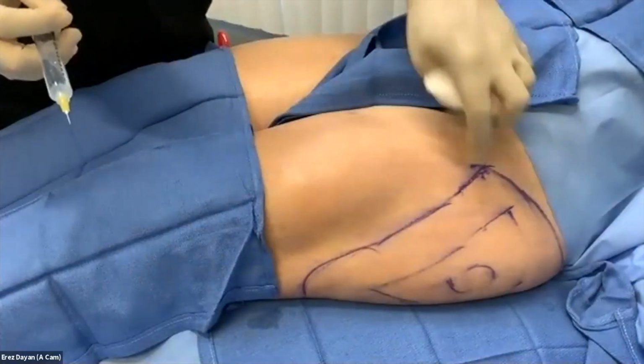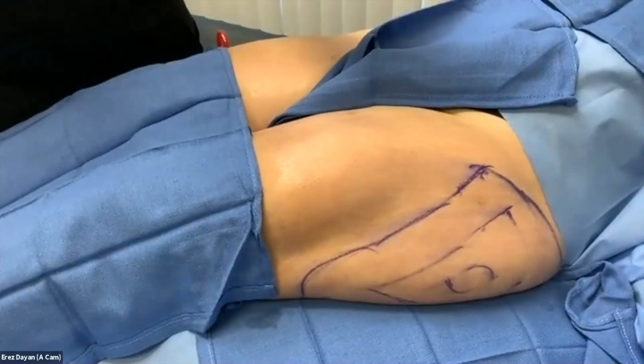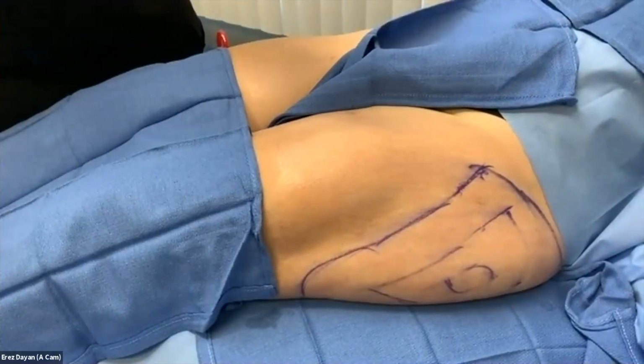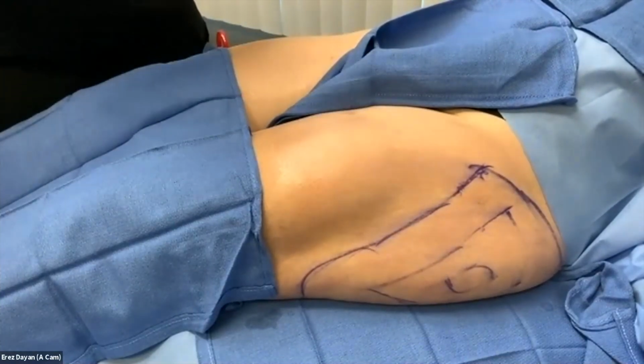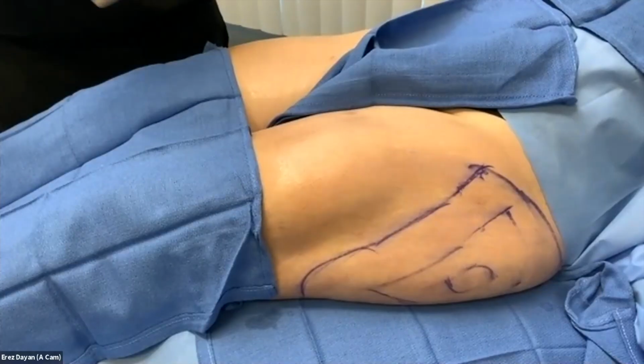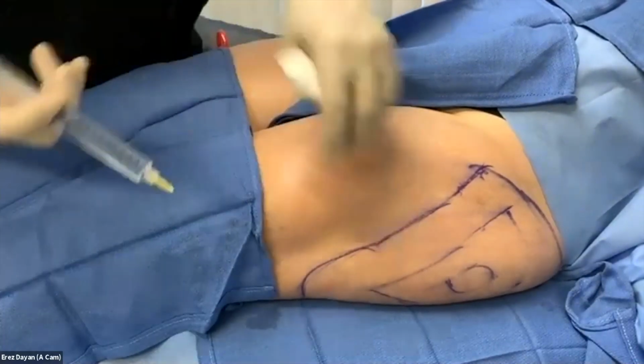So basically, when she was standing up, I simply marked the areas just like I would for a lipo case, because I am going to do lipo at the end of this. I always do radiofrequency first and then do lipo second. The reason for that is because your fibroseptal networks are most extended before lipo, so it's best to do radiofrequency first. It's safer too.